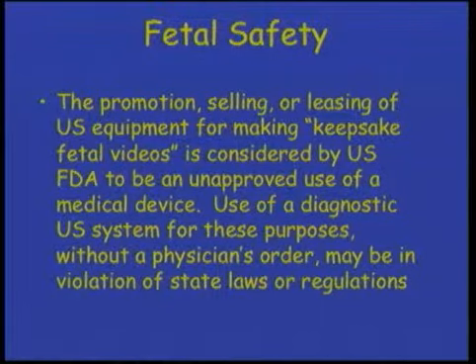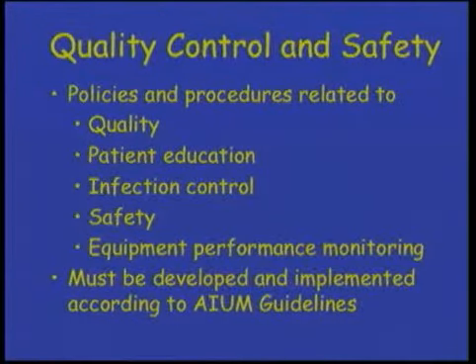The AIUM tells us that the promotion, selling, or leasing of ultrasound equipment for making keepsake fetal videos is considered by the FDA to be an unapproved use of a medical device in the United States. Use of a diagnostic ultrasound system for these purposes without a physician's order may be in violation of state law or regulations.